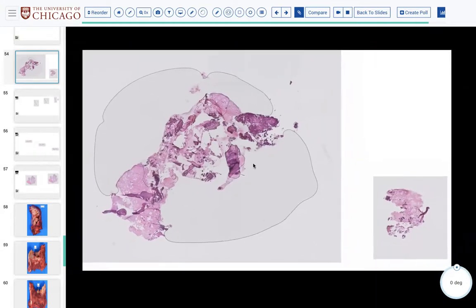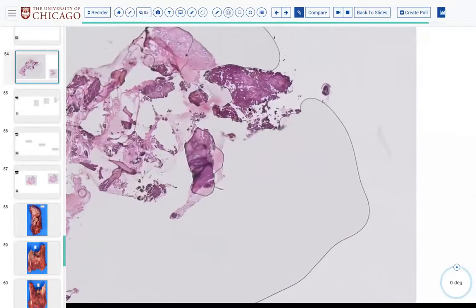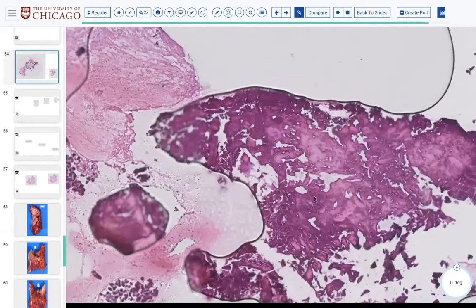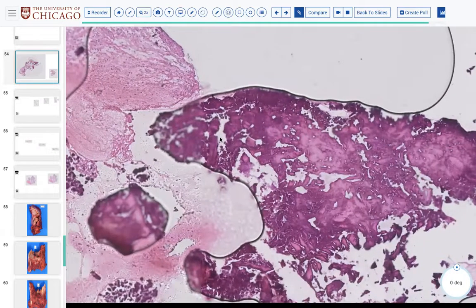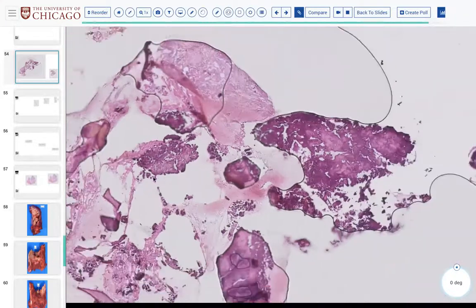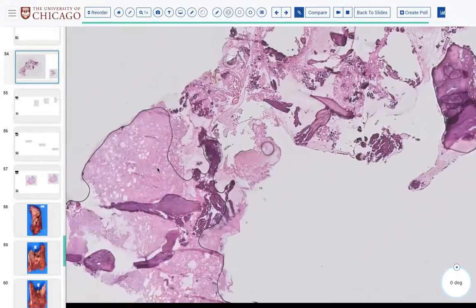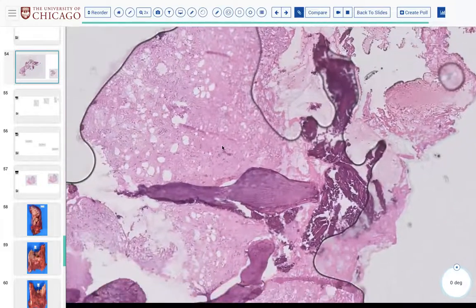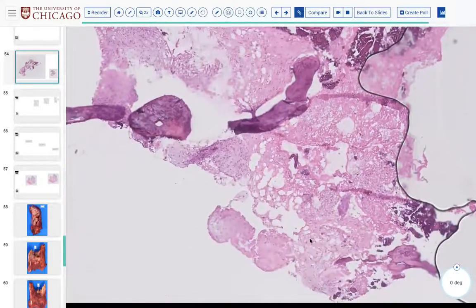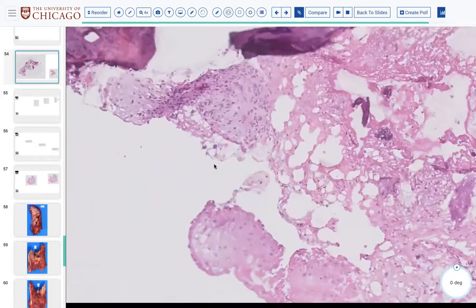This is a fleck of marrow with bone from that site. And if there are small chunks of bone, I think they can cut okay, as you can see in this case. But you want to be looking for anything that's epithelial, essentially. That's squamous.